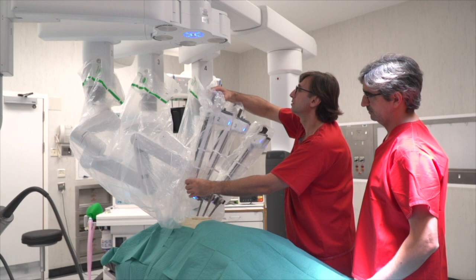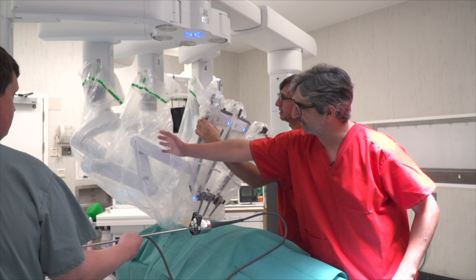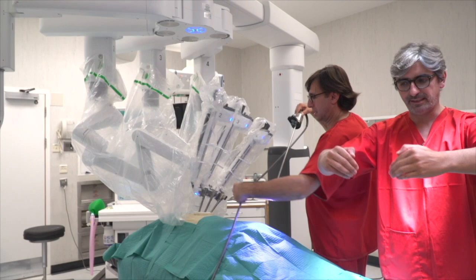The camera, please. And now with the clearance, you see the clearance? We need to do clearance here. Clearance, yes, but the distance we already did is good now. Before, but we need to move the elbow and have more space, okay? Because if they are too close, maybe there will be more collision. You have to move like this, to have the space here between the joints. So you have to be sure that the clearance is always open, okay? Not like this. Otherwise, we'll collide.